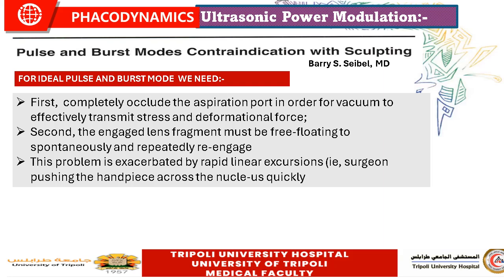So this picture, along with the fast movement of the phaco handpiece, will exert a severe stress on the zonule of the patients, and may lead to the nucleus falling down or a tear in the zonule of the patients. So he advised, and actually contraindicated, the use of the traditional pulse or burst mode in the sculpting stage.